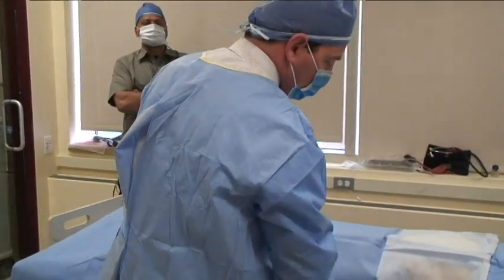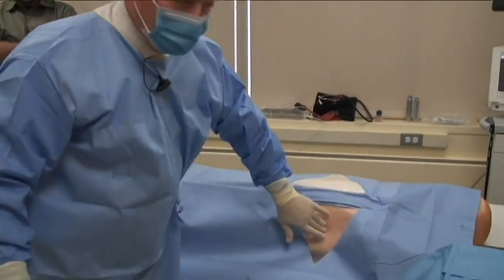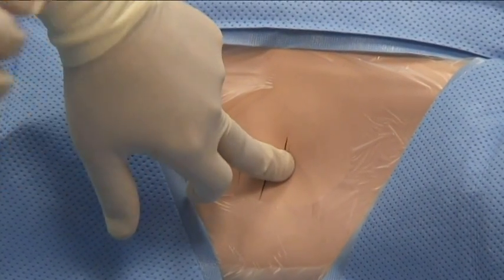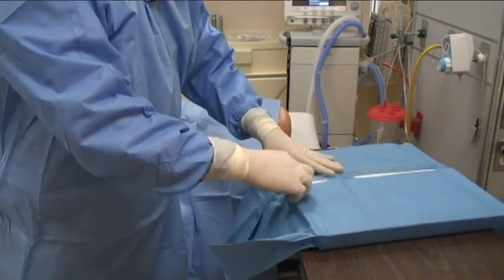So now we have a nice, full, sterile field to work with, and my area is prepped and ready to go. I'm feeling for the top of the rib, where I'm going to actually put the needle in, and ultimately the chest tube. So I'm going to open up my kit now and go through its contents with you.